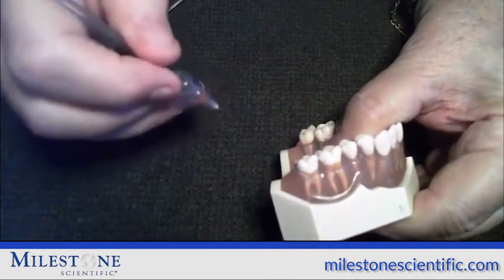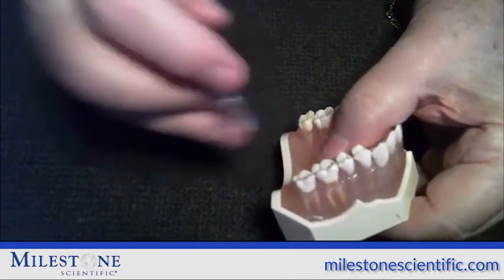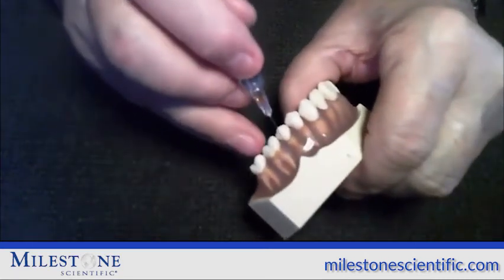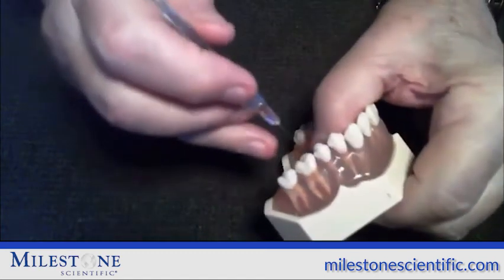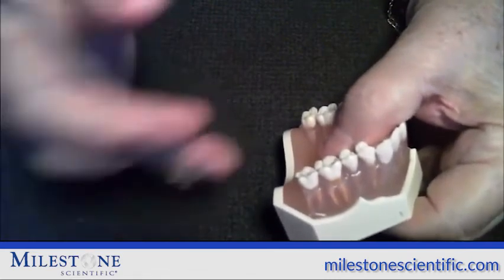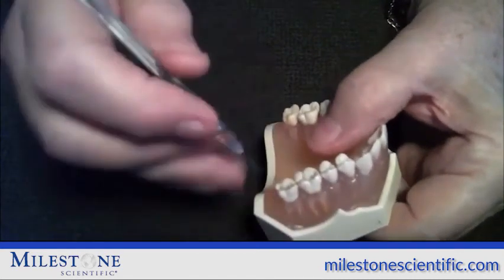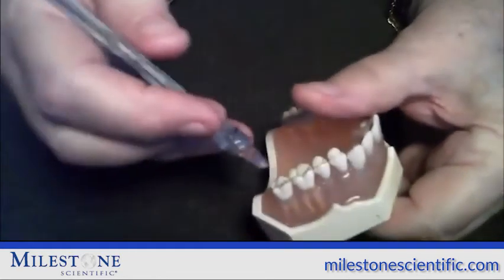On the maxillary teeth, what about the palatal tissue? What about the palatal root? We don't have to do anything. If we put half a cartridge on the distal, then put the rest of the cartridge of lidocaine on the mesial, that tooth is anesthetized for extraction, endodontics, crown, anything you want to do. There's no need to do anything on the palatal tissue and on the palatal root. That area is also numb from that one injection.